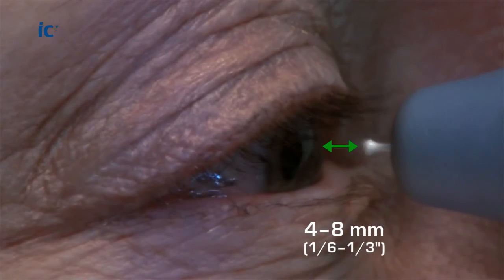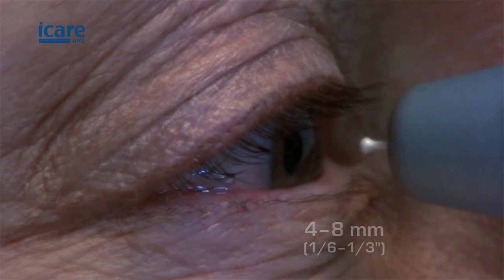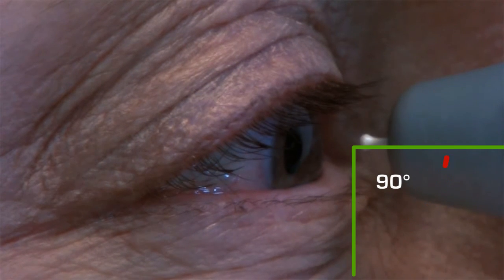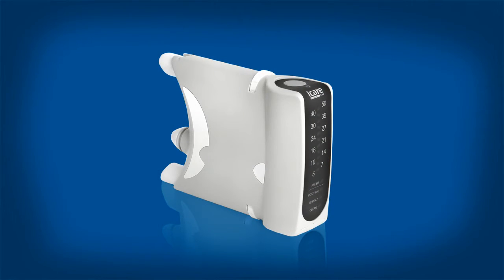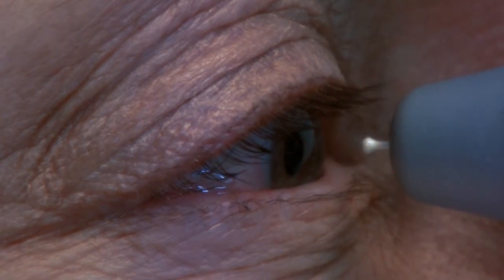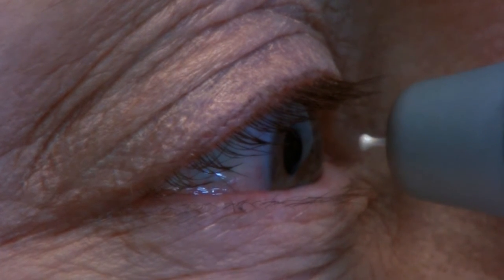Bring the tonometer near the eye. The distance from the tip of the probe to the cornea must be 4–8mm, or 1/6 to 1/3 of an inch, and the tonometer must be at a 90-degree angle. Press the measurement button lightly to perform the measurement, taking care not to shake or move the tonometer. The tip of the probe should make contact with the central cornea.